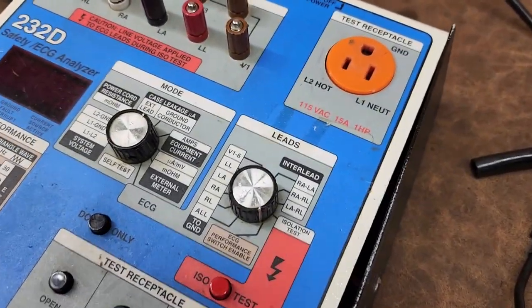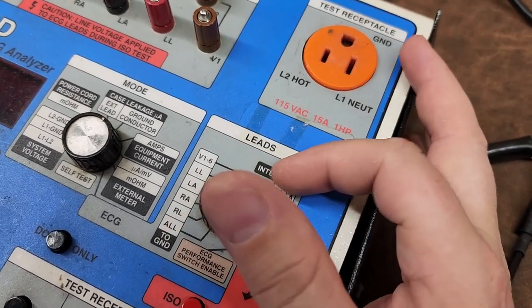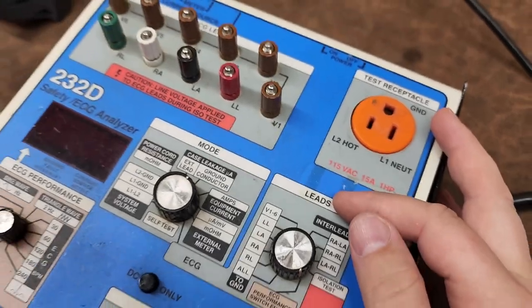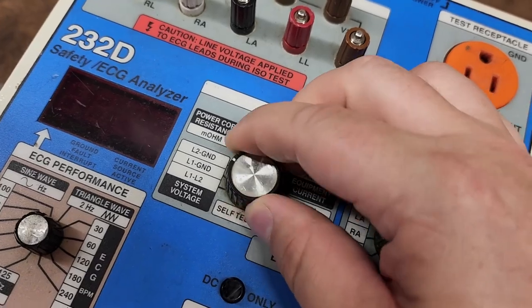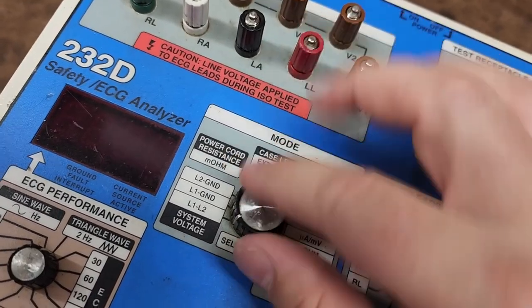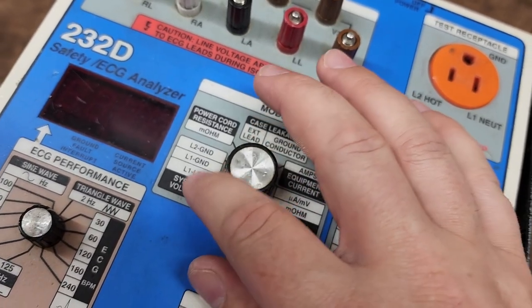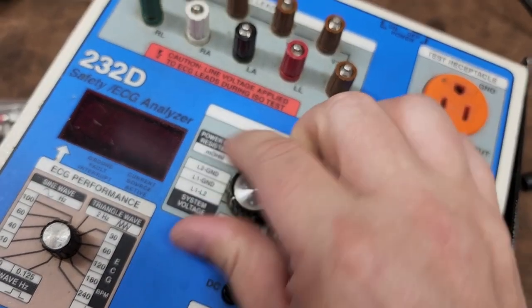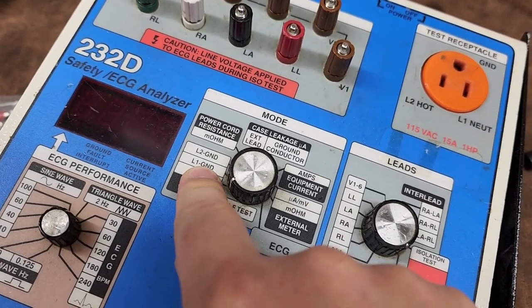Notice that it has ECG functions right here. Right here is where we do lead-to-lead for the analyzer. This is your main mode function. Some of the things we will test mainly is system voltage — you can do L1 to L2, L1 to ground, L2 to ground. This here helps you find faults.